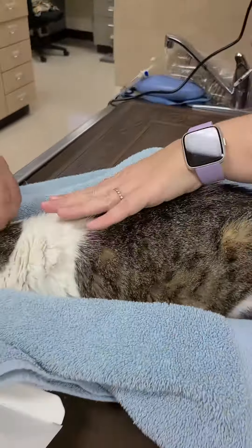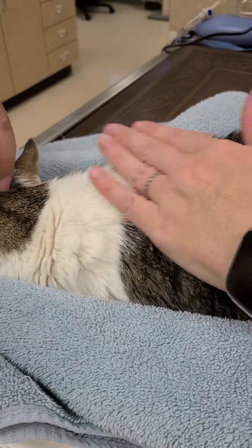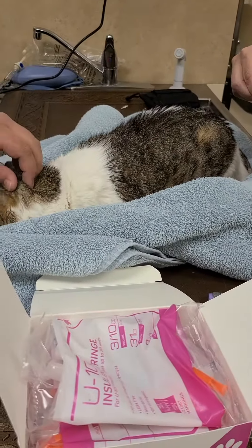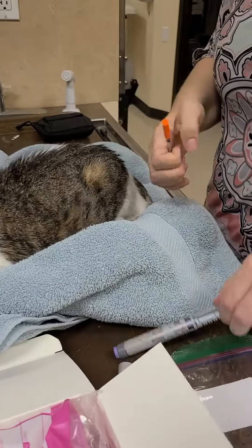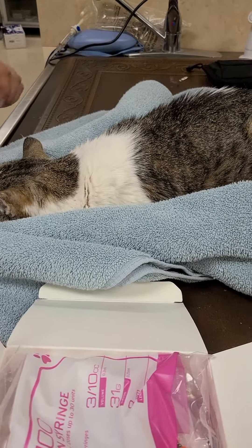I'm sorry, Penny. And then usually I just kind of feel the area, see if it's wet. If you feel any wetness, that means you may have missed or gone through the other side. If you're unsure, don't repeat it, because if you give her too much, she'll become hypoglycemic. And that's how you give her the shots. You can give it twice a day.